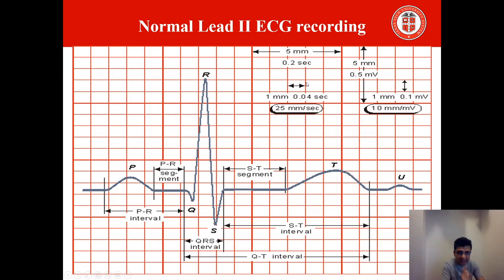Now, the second thing to remember is that there are two axes. This is the x-axis if we move on this line, in this direction from left to right or from right to left. And the other axis is the y-axis if we move upside down. So on the x-axis, we have the time in milliseconds or seconds to be specific.